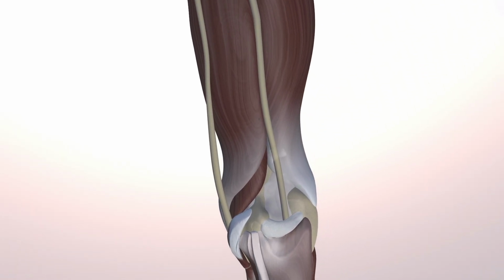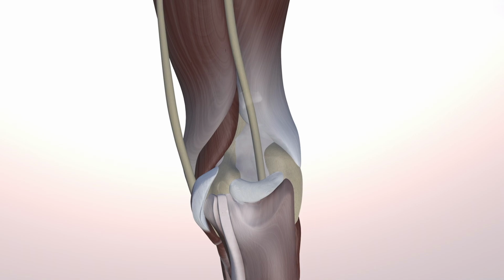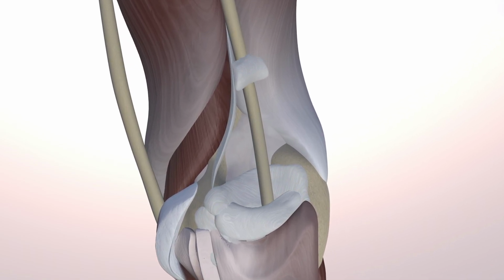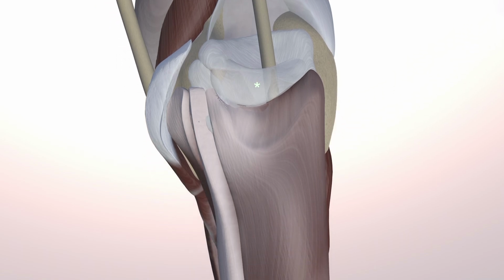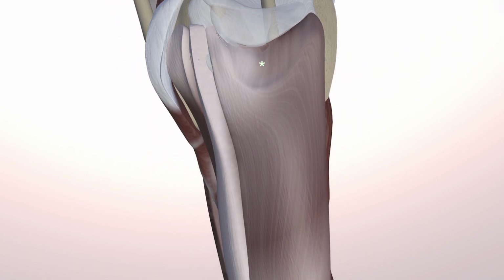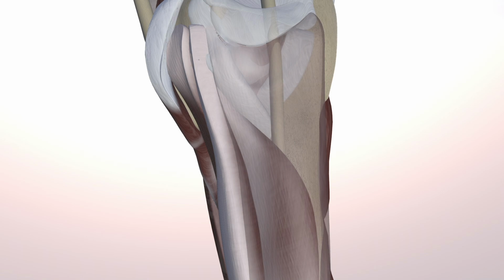We can see the ulnar nerve crosses under the arcade of Struthers, which is translucent here. Now we're making it more opaque. And then it passes under the Osborn fascia, and then under the arcuate ligament, which essentially bridges the two heads of the flexor carpi ulnaris muscle.